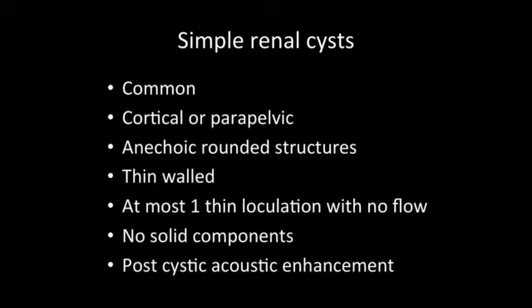Generally, there should be no loculations within a simple cyst, although people will accept up to one very thin loculation as long as there's no blood flow demonstrable within it. There shouldn't be any solid components within a simple cyst, and it should demonstrate post-cystic acoustic enhancement. So if it's got all of those things, it's probably a simple cyst.